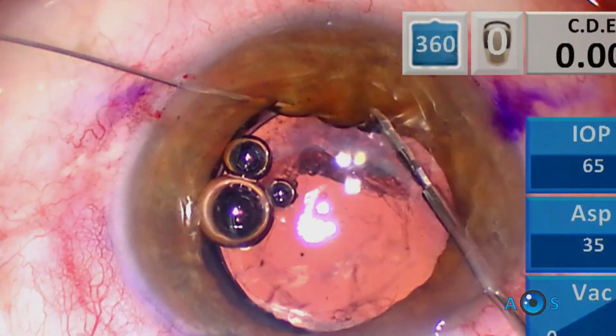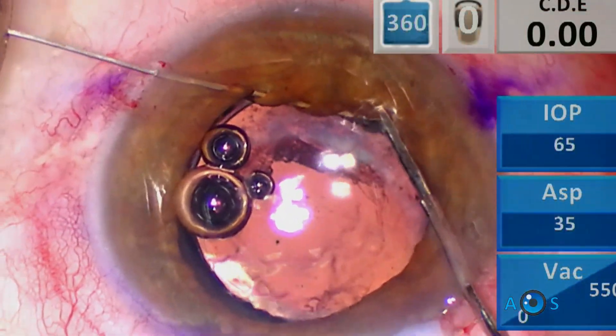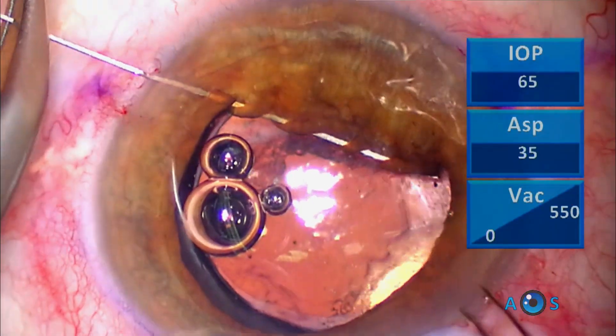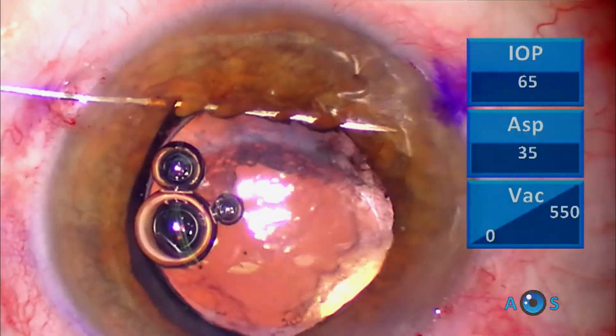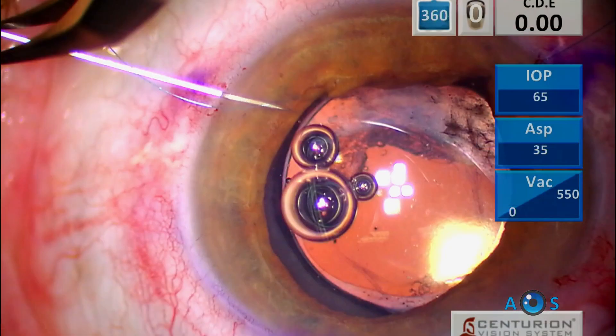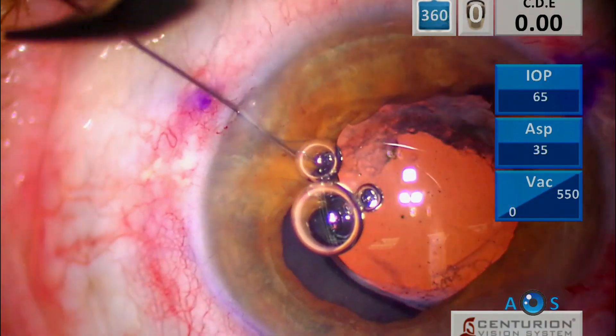To achieve the result, the major step is to direct the straight needle into the iris sphincter in order to pierce through it. Then the needle is angled above the iris and the forceps is used to grab and direct the iris sphincter against the straight needle, which then advances through. About four to five needle bites will be taken to complete each segment of the pupil.